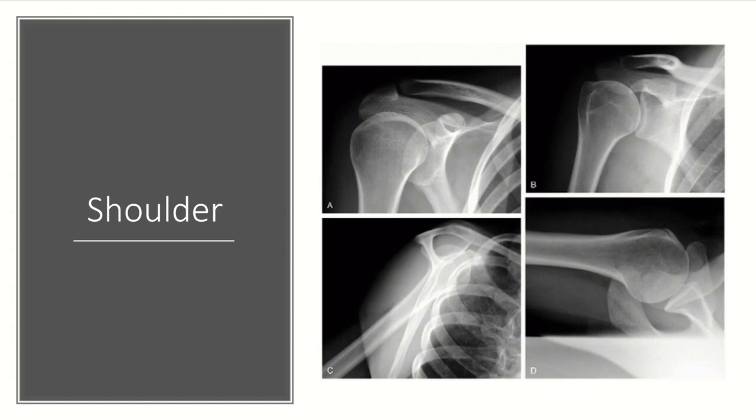With respect to the shoulder, we typically get four views. We get an AP, a true AP which is called a Grashey view — you can see how the glenohumeral joint is better visualized here than on the standard AP. We get a scapular Y, called that because the scapula looks like a Y. Then we get an axillary view, which is a good view for visualizing joint congruency. You can see the glenoid and the humeral head well here, confirming the joint is congruent and not dislocated.